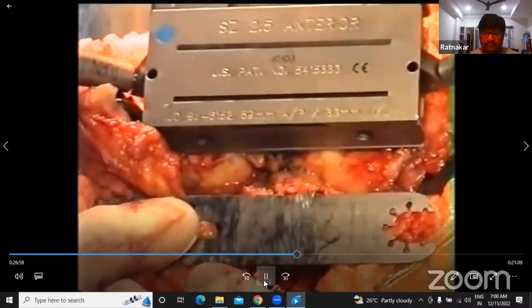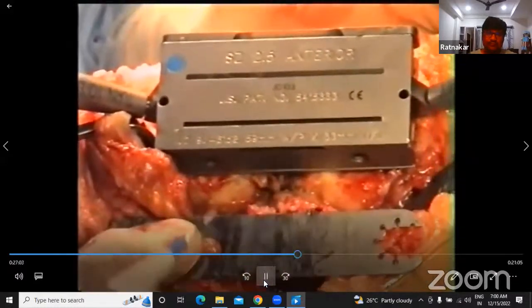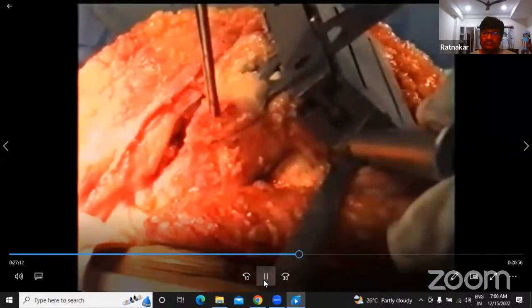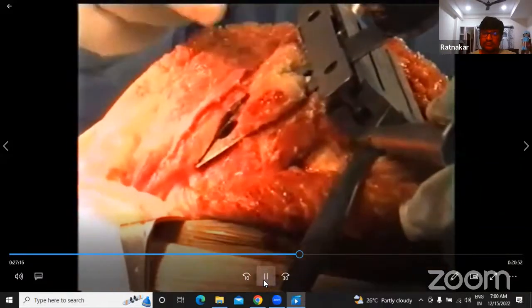Another important thing is, if you put one blade perpendicular to the tibial axis, this should make a quadrangle box here. See, that is the cut portion, and my blade is exactly on the anterior femoral cortex. It should not notch.